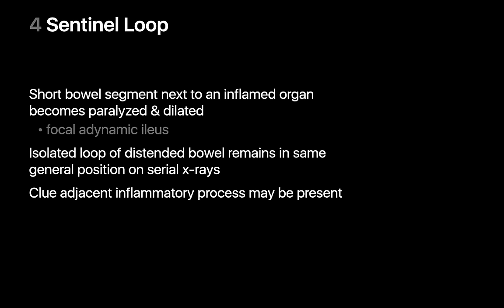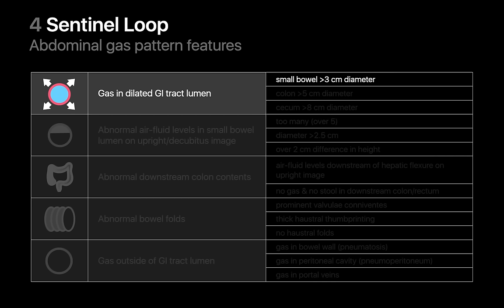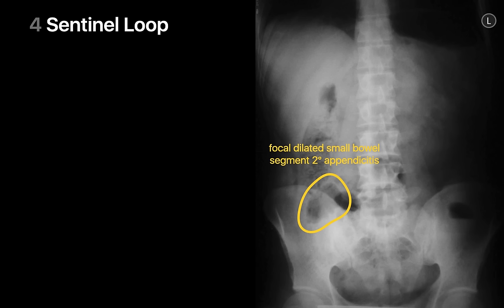A sentinel loop can occur when a focal inflammatory process in the abdomen leads to focal adynamic ileus within a short segment of adjacent small bowel. A sentinel loop in the right upper quadrant can occur with disorders like acute cholecystitis or pyelonephritis, while a sentinel loop in the right lower quadrant may occur with appendicitis. The x-ray finding is straightforward — a short segment of dilated small bowel. In this example, a short segment of gas-filled dilated small bowel is present in the right lower quadrant in a patient ultimately diagnosed with acute appendicitis.